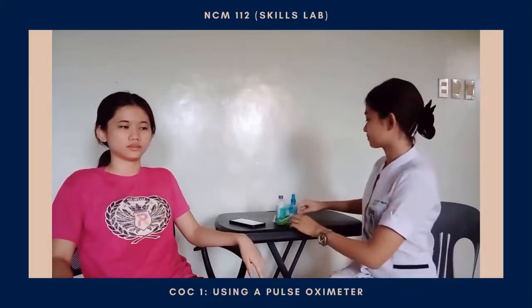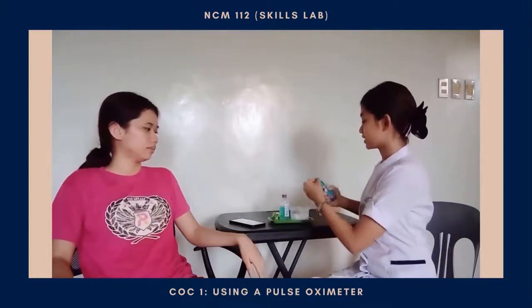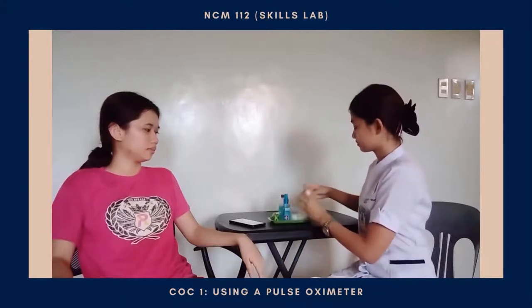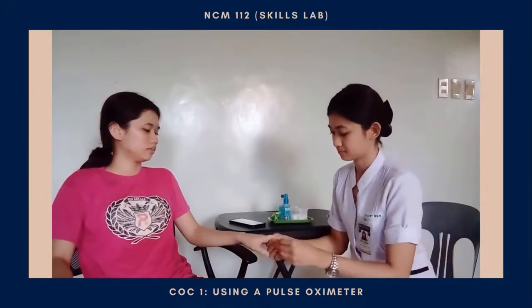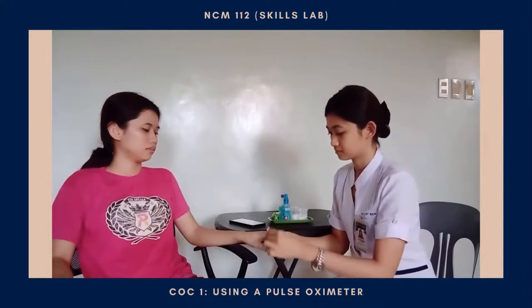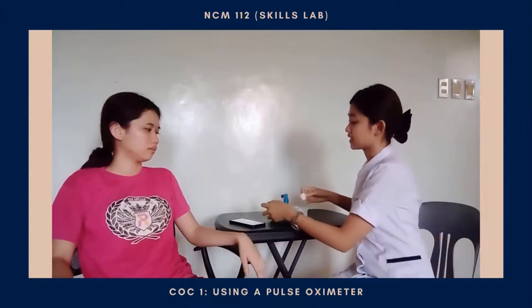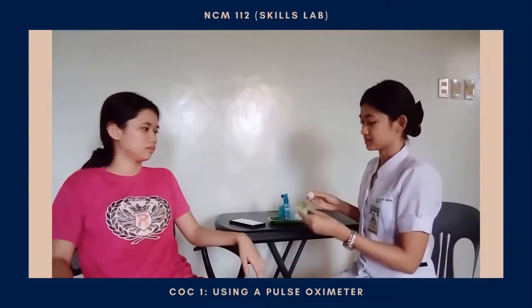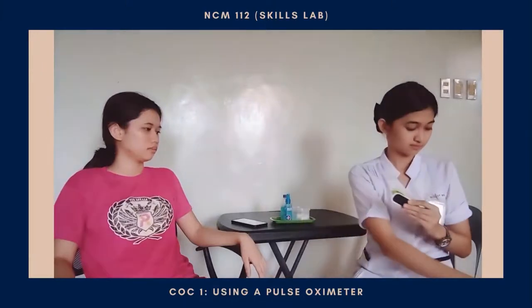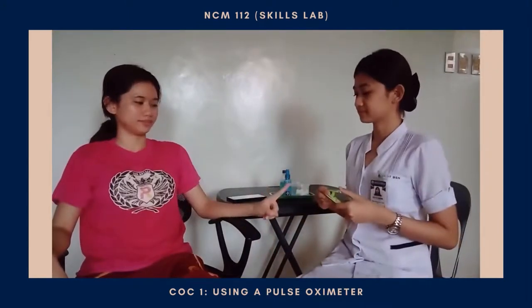So now I will proceed in cleaning your index finger. And also clean the pulse oximeter device. Okay, ma'am, can you point out your index finger for me?